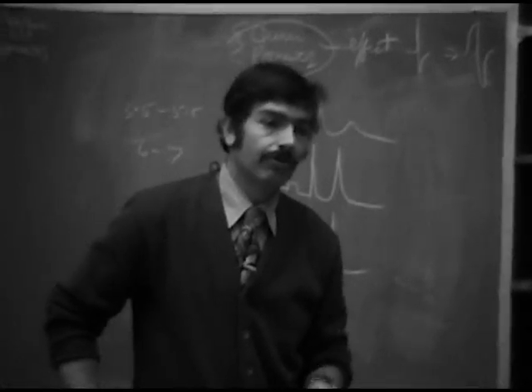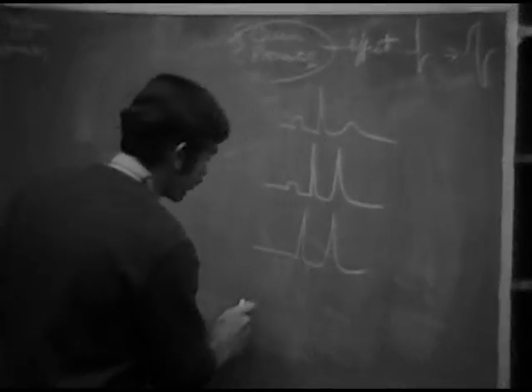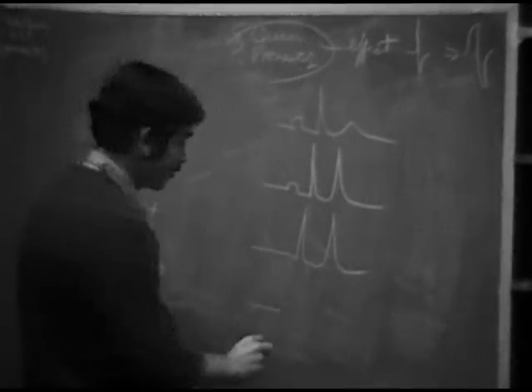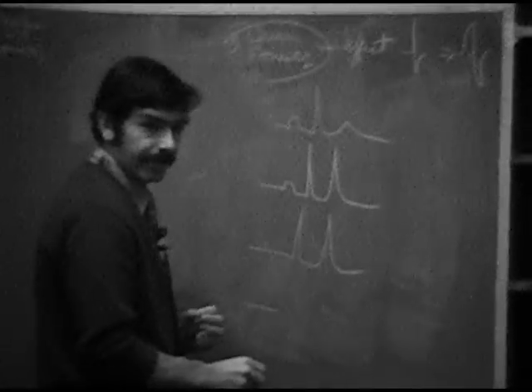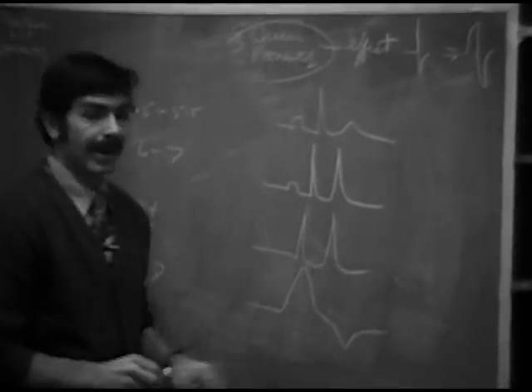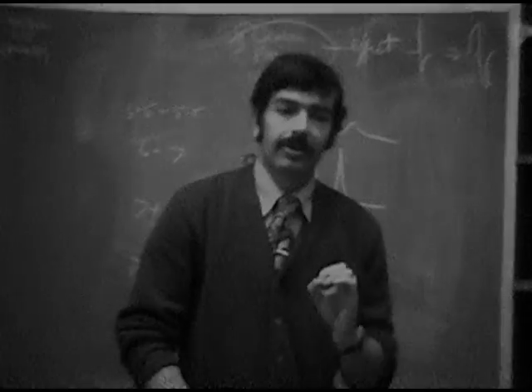Broadening of the QRS, or intraventricular block, again, as we pointed out. And when you see intraventricular block, you've very frequently lost your P wave, even though you still have atrial contraction. You'll wind up with a wide QRS, and you may get a secondary T wave change, so you might lose your T wave peaking.